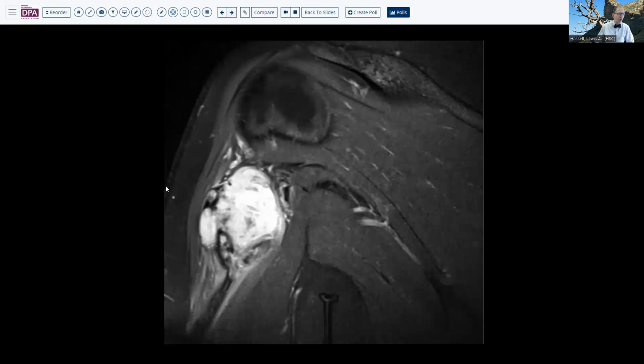So just to review what we had with our particular case, as you can see here, is an irregular, variably attenuating lesion, hyperattenuating lesion on MRI here around the shoulder joint, and perhaps extending along tendon lines adjacent to the bone and into, but maybe not penetrating into these muscle planes, but involving the fascia and so forth.